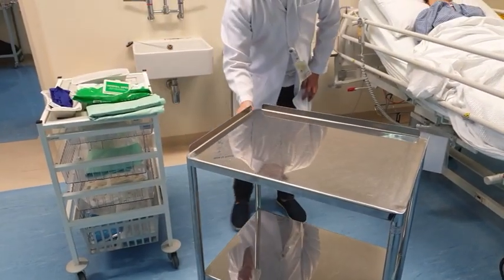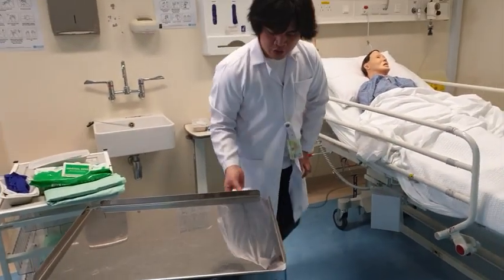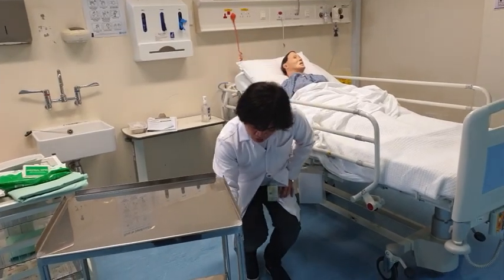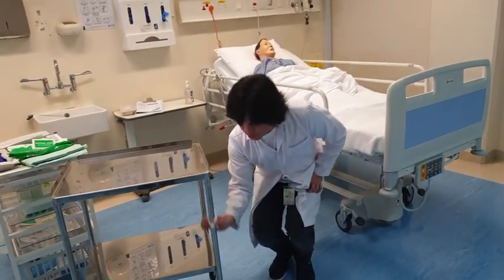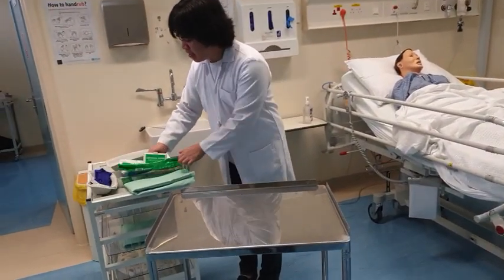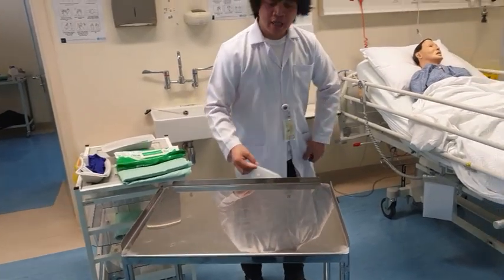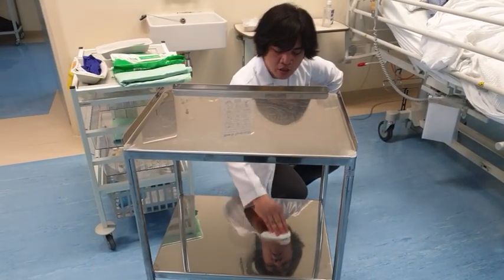Use the other side again, from the top down, one direction. Use the other side from the top and on this side as well. And finally, the bottom part, you need to disinfect as well, starting from the center in circular motion.